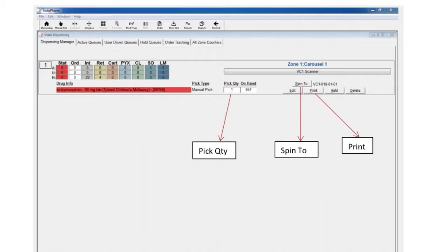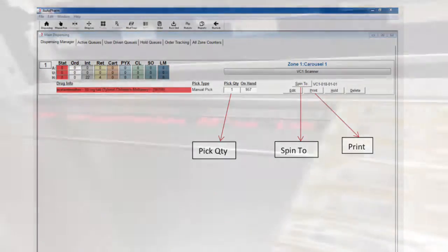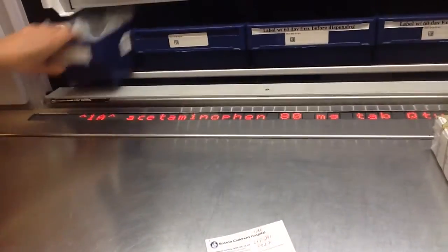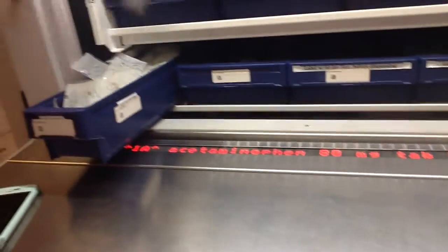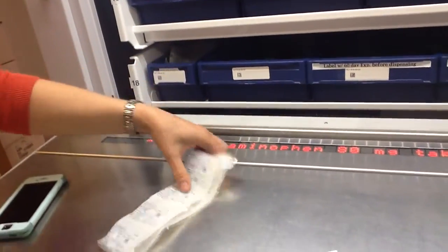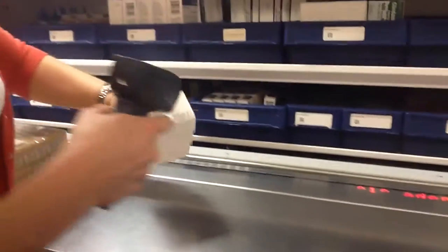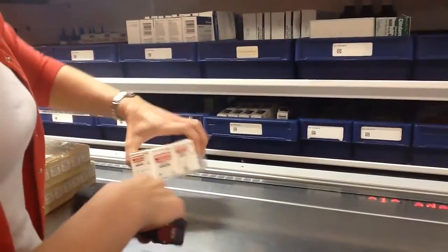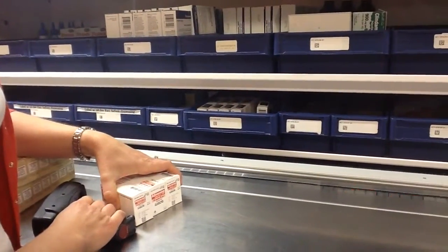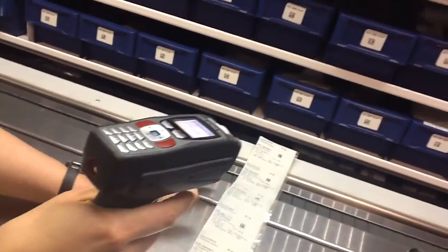Get desired quantity from bin. Be sure to push the bin back in completely. Scan the barcode on the medication package. The tick bar will clear when the transaction is complete. If the tick bar remains lit up, the transaction is still active. Do not walk away until the transaction is complete.